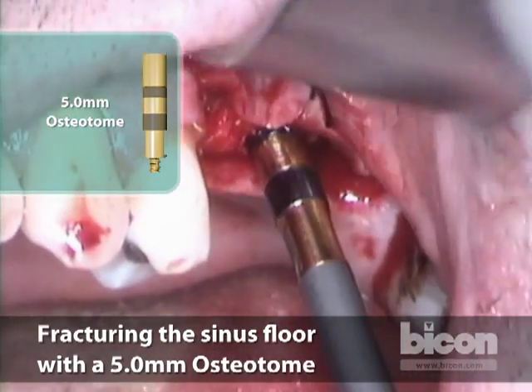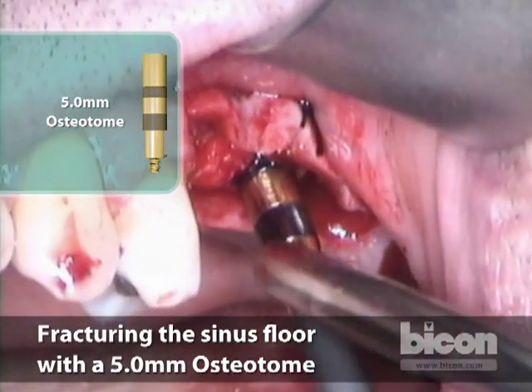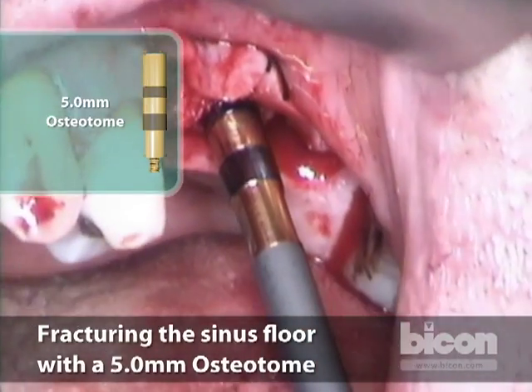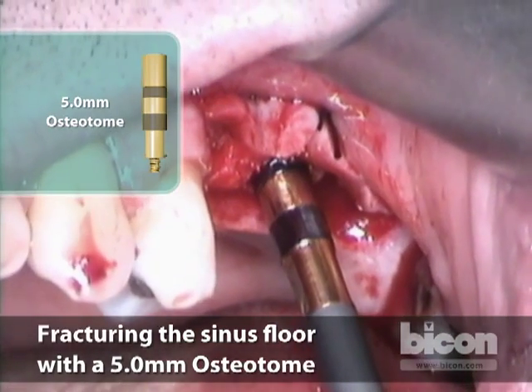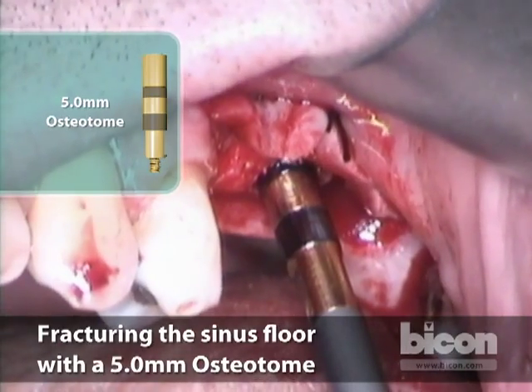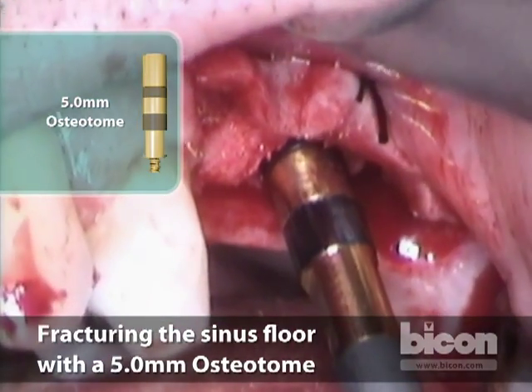I want to mobilize it by about four millimeters, which means I have to reach the top of the first mark. I'm still tapping when I know it's fractured — that allows me to make sure all the sides of that osteotomy are freed up. And here we are — done.